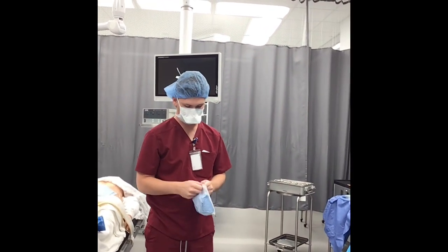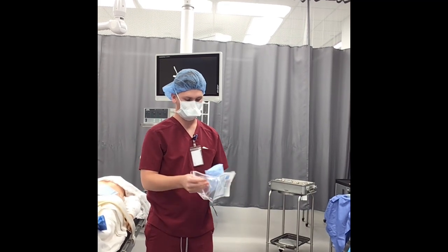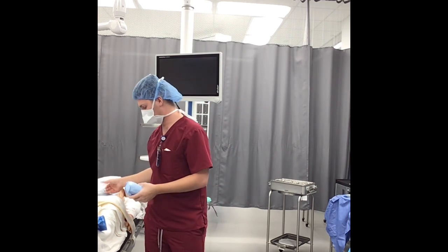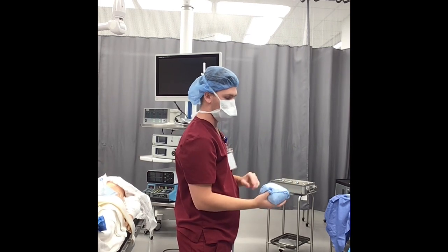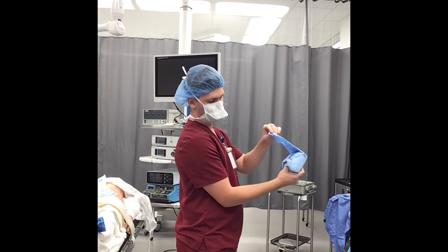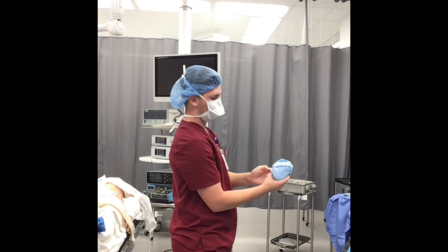So next thing I have is my lap sponge. So I'm removing them out of the dust cover, checking for any holes. Looks good. And then I have my envelope wrap just like my gown and my basin. So I'm holding the contents of my package in my right hand, and then I'm going to open up my first flap away from me.